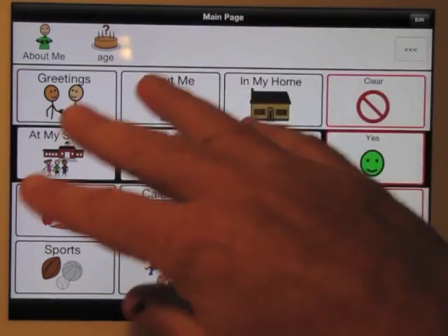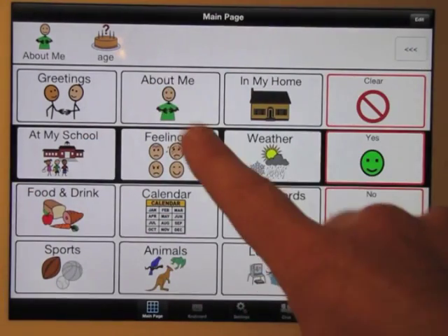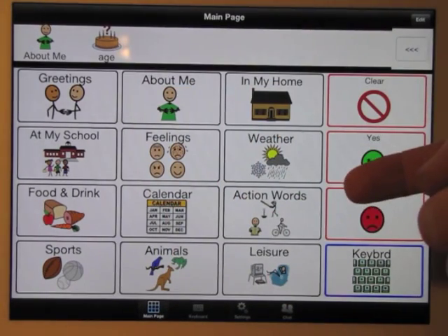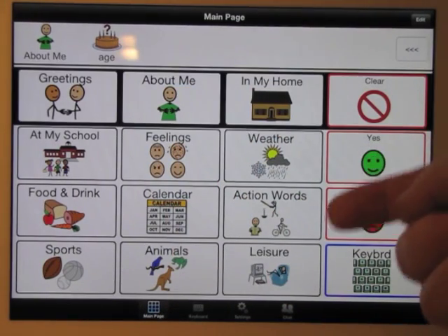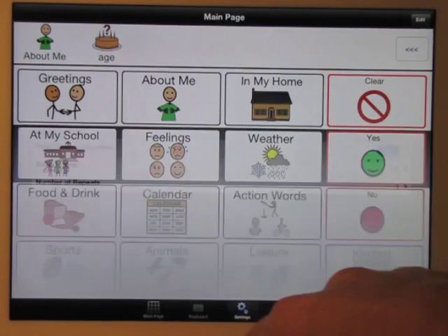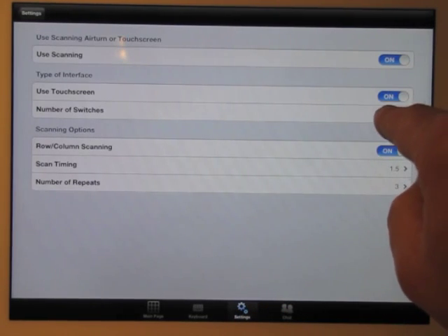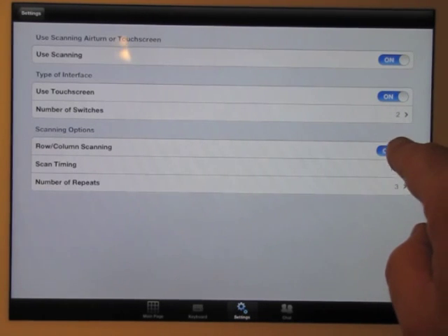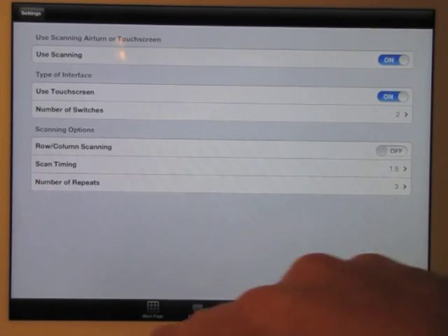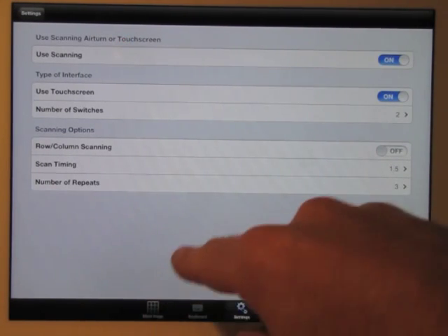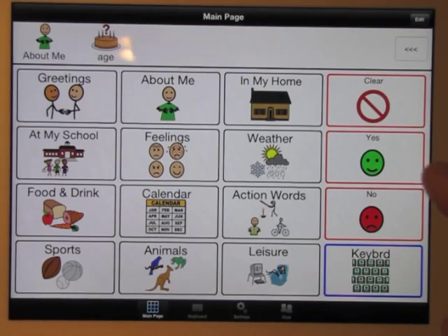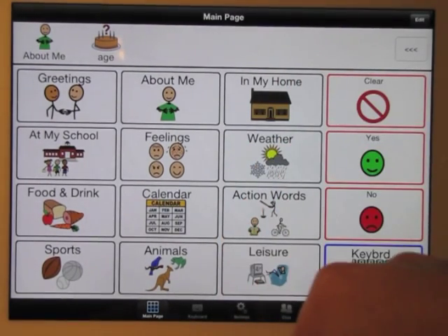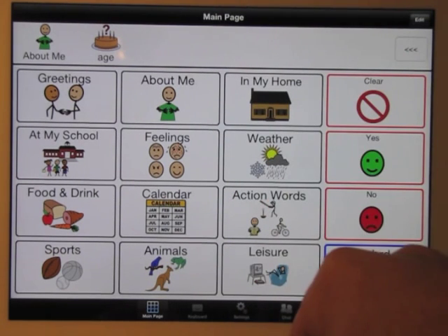So that was using the whole screen as a single switch, both in individual step scanning and in row column scanning. Let me switch this now over to two switch scanning. I'll take row column off to start — this will be step scanning using two switches. Invisibly, there's a line down the middle of the screen, whether it's in landscape or portrait. This works on iPads, iPods, or iPhones.